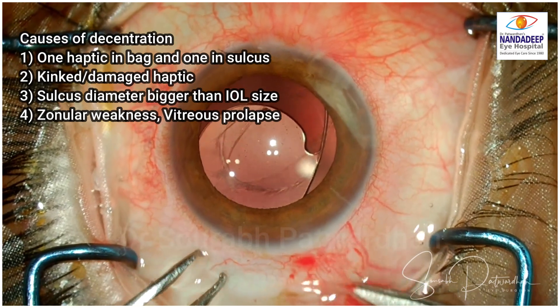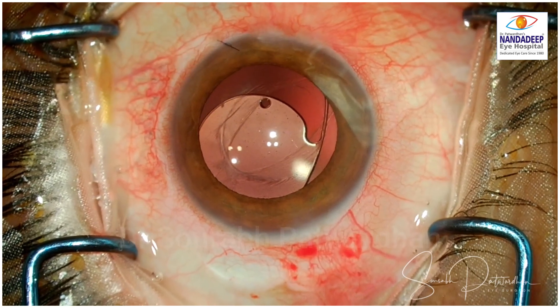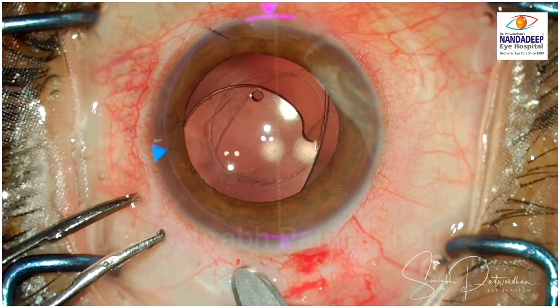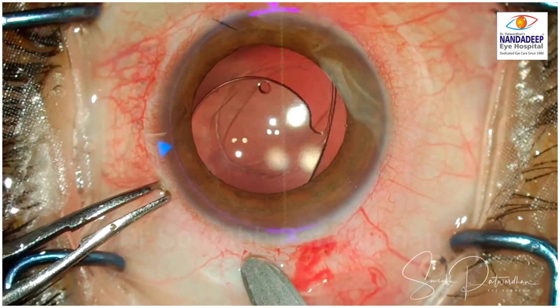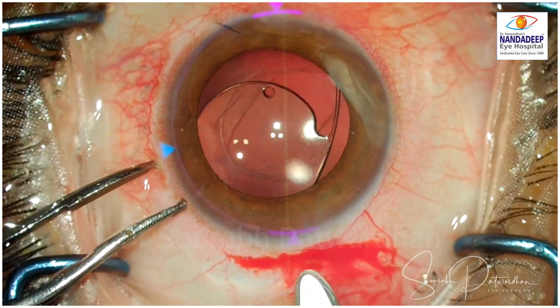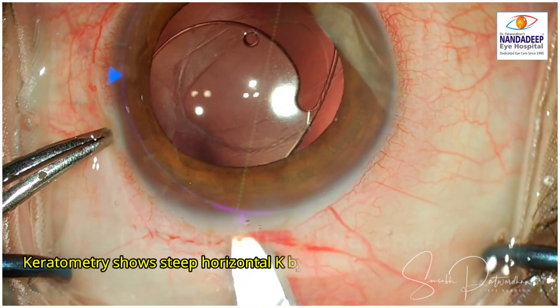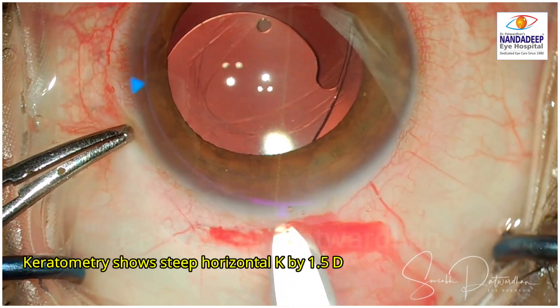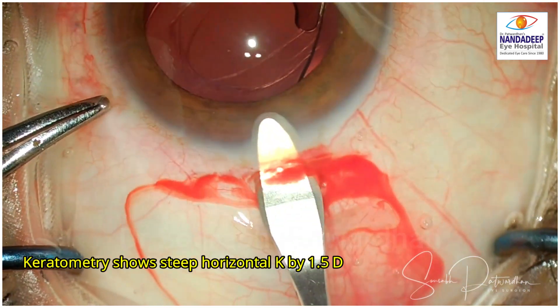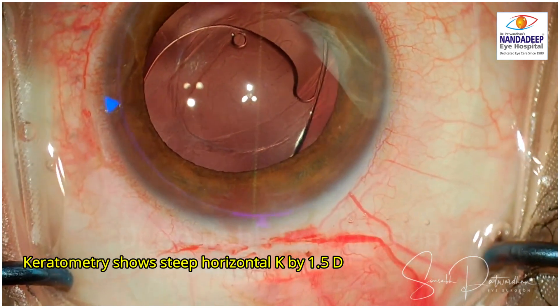We commonly use this IOL in India for sulcus placement as it is the least expensive option, and we find fairly good results. But as you can see, in some cases it may not center very well in the sulcus and may need to be exchanged. To address the against-the-rule astigmatism — which was caused by the superior tunnel done by the surgeon to remove the nucleus once the rent was noted — I am going to make a temporal scleral incision.